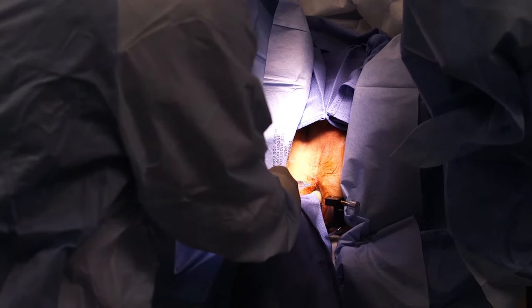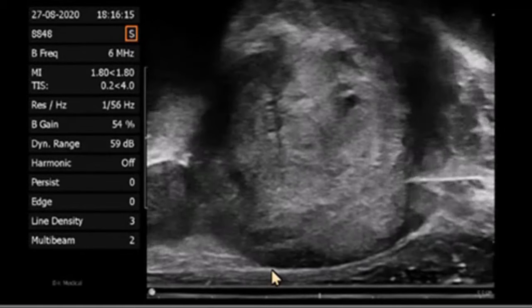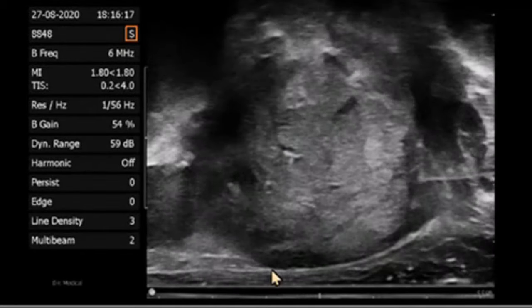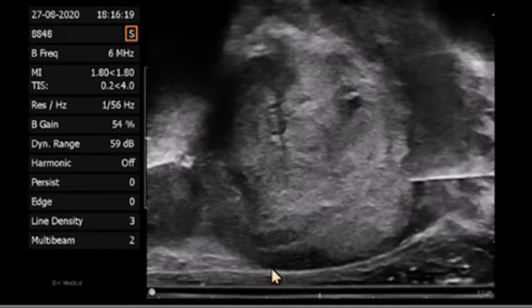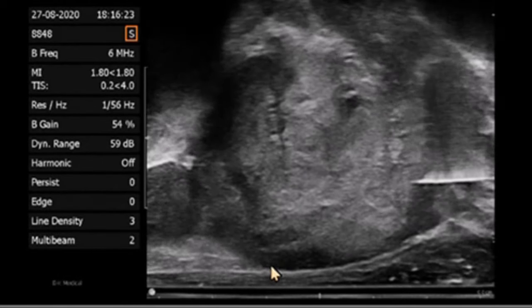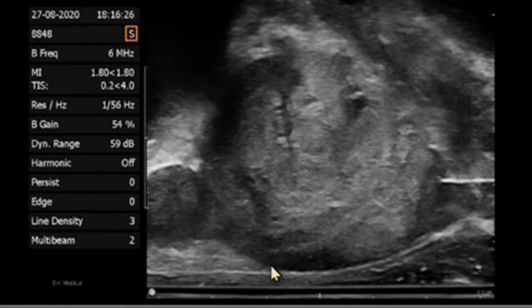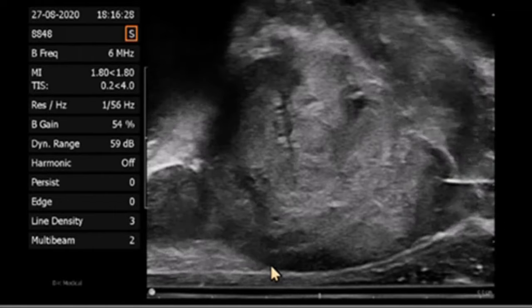This aspect of local anesthesia should be performed quickly since it only provides anesthesia at the needle insertion sites at the skin level. The prostate nerve block is then performed by injecting 5 cc's of 1% lidocaine between the prostate capsule and levator muscles. Air should be removed from the syringe prior to injection to prevent the introduction of air artifact around the prostate. Lidocaine should be visualized expanding the distance between these two structures if given in the correct space.